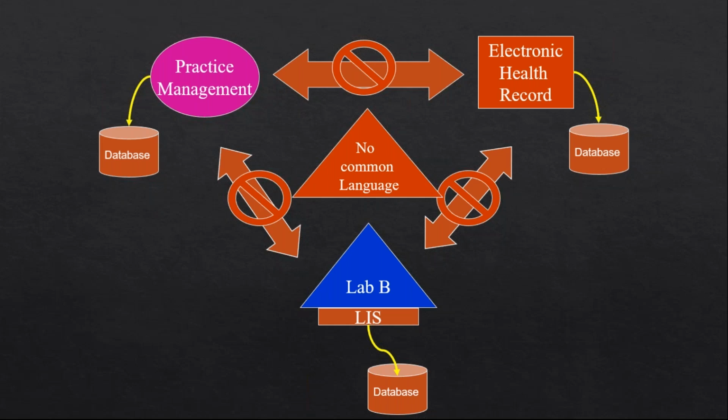In the same way, if the practice management or the EHR has to deal with the lab database, again they have to end up learning. The same software engineer has to end up learning the database architecture of the laboratory information system.